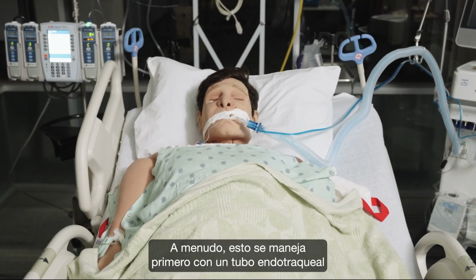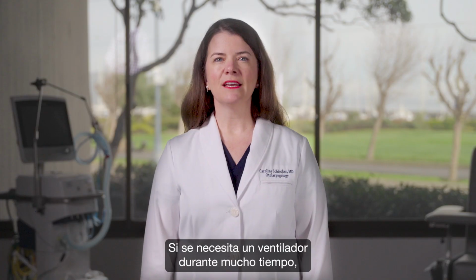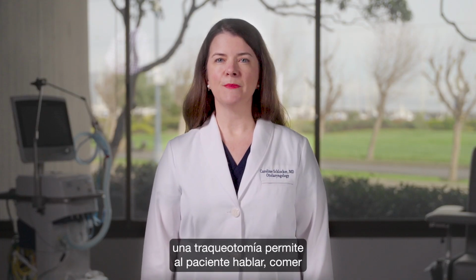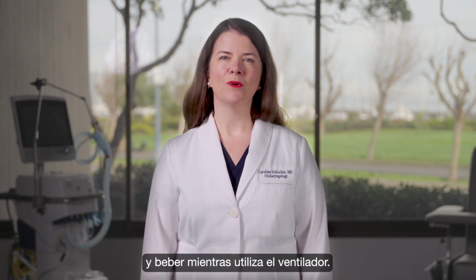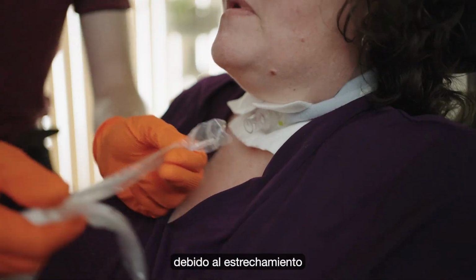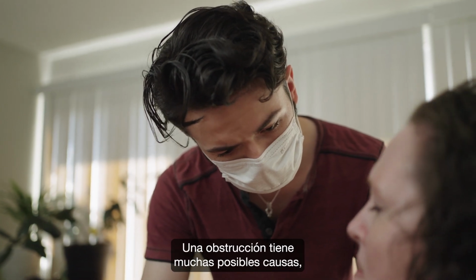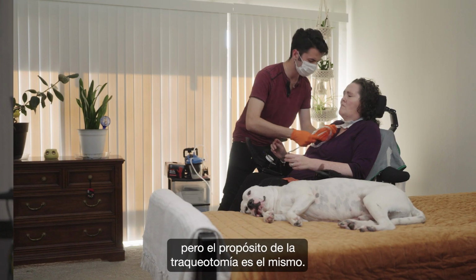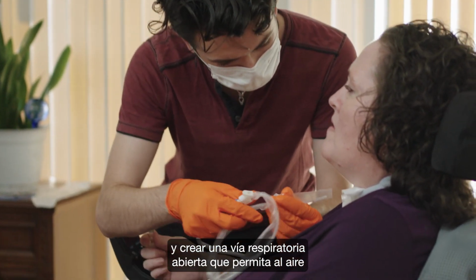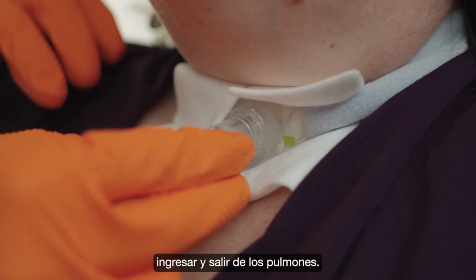Often, this is first managed with an endotracheal tube through the patient's mouth or nose. If a ventilator is needed for a long time, a tracheostomy allows for a patient to speak, eat, and drink while still using the ventilator. Some patients need a trach due to the narrowing or obstruction of their airway. There are many possible causes of an obstruction, but the purpose of the trach is the same: to bypass that blockage and make an open airway that allows air to pass into and out of the lungs.